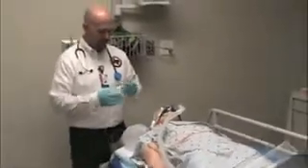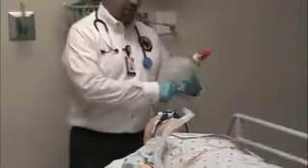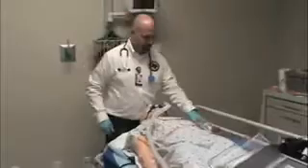And I'll usually just run the tubing through the mask so that I always know exactly where my mask is, and it's just a second nature habit. So this should always be with you and readily available.